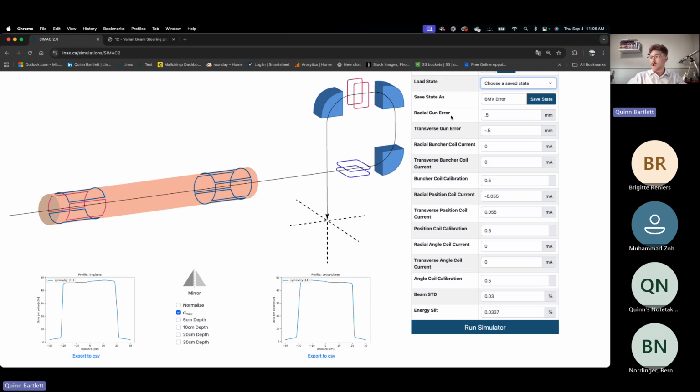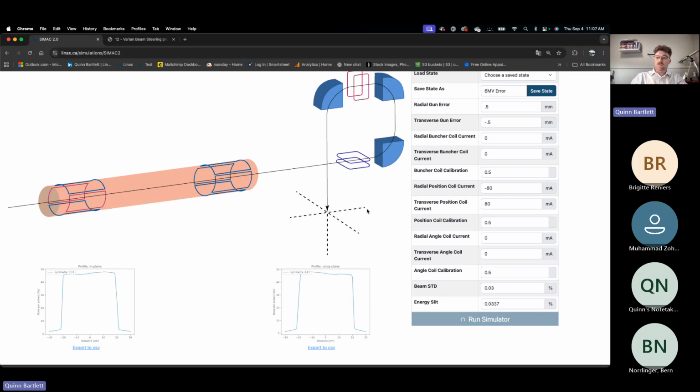So for our radial gun error, we're going to want to go to the radial position coil current and give that some milliamperage. I'm going to give it -80 to try to steer it back. Then we'll do our transverse position coil current as well to get our cross plane back symmetrical. I'll give it the opposite, the 80 milliamps. And so we can run this simulation now, and then we will see the output of our profiles.